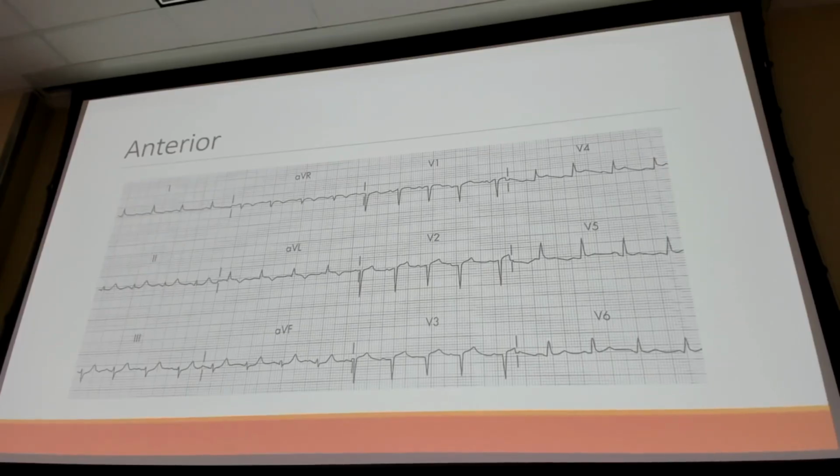Yeah, this one, so we don't have any reciprocal changes. This is an anterior MI. The tricky part is when it's very subtle like this, so maybe it's over 1 millimeter, maybe 2 millimeters in some of the leads.